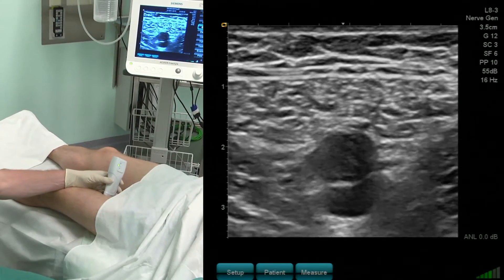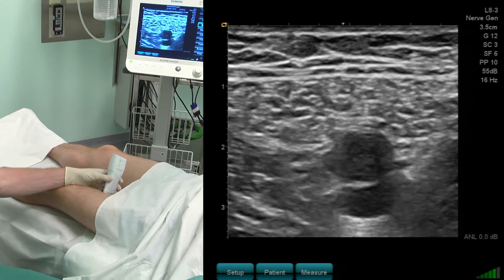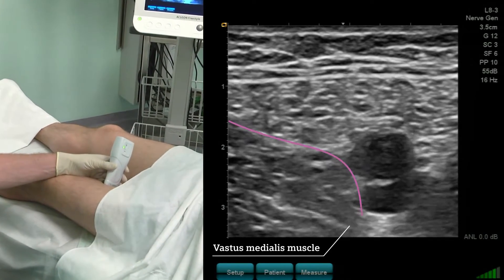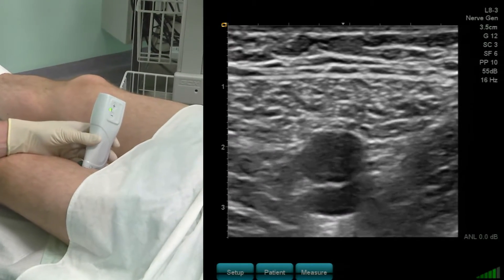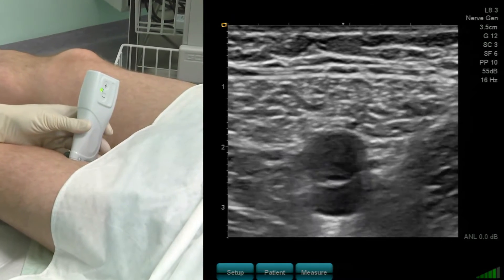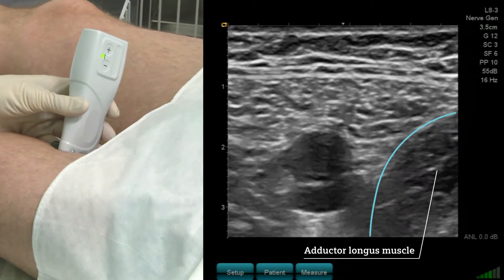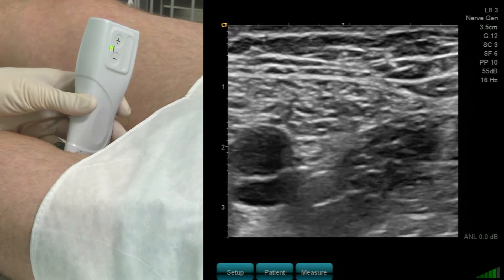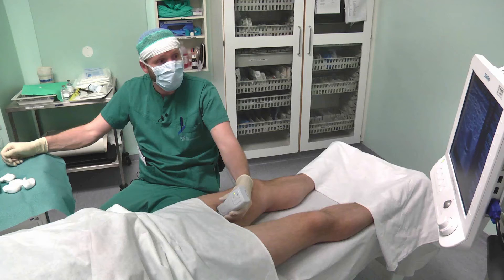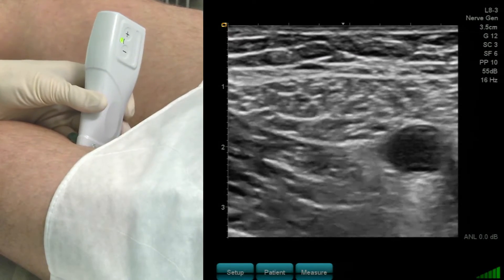I can compress the vein. There are two other muscles: in the anterior lateral direction we see the vastus medialis muscle, and on the medial posterior direction — right hand side on the ultrasound image — we see the adductor longus. Below the adductor longus is the adductor magnus. On the anterior lateral side of the artery, we now try to identify the saphenous nerve.